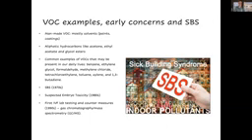and we were one of the labs that published on this. These were used and yielded information that was very interesting. We looked at correlations with particularly pregnancy outcomes and developmental rates of embryos. And we also looked for incidents of toxic spills or other events.